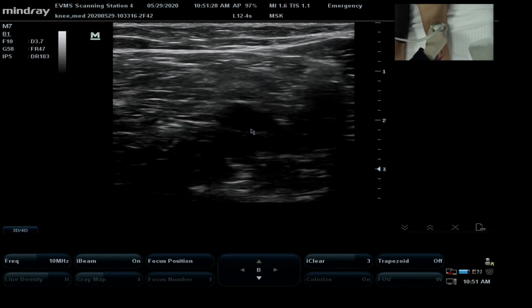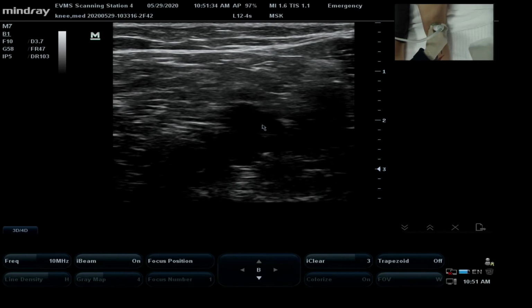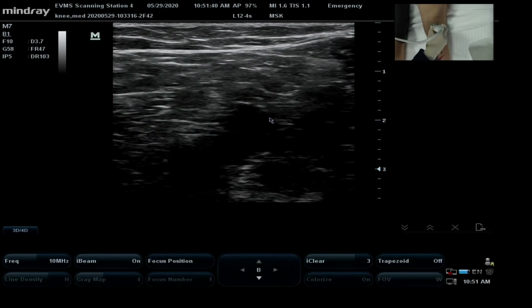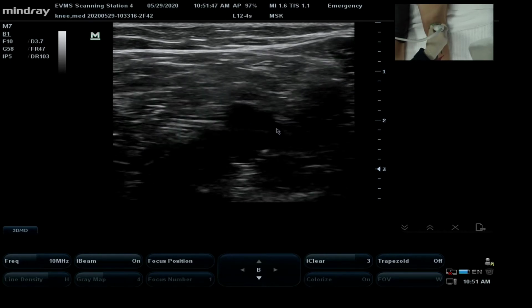So you can carry that concept into any large vein that you'll be looking for when you learn about looking at the femoral vein. You use that same pressure to be sure you don't see clot obscuring or preventing that vein from functioning.